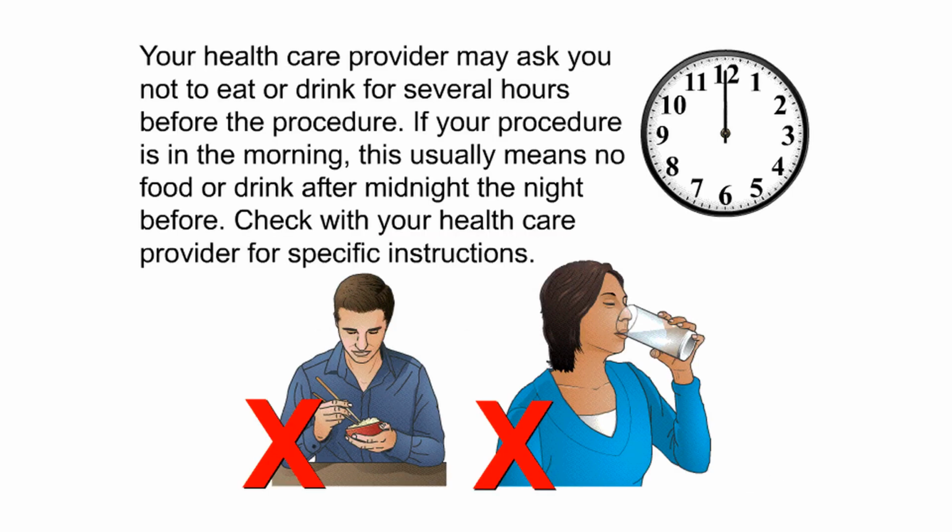Procedure. Your healthcare provider may ask you not to eat or drink for several hours before the procedure. If your procedure is in the morning, this usually means no food or drink after midnight the night before. Check with your healthcare provider for specific instructions.